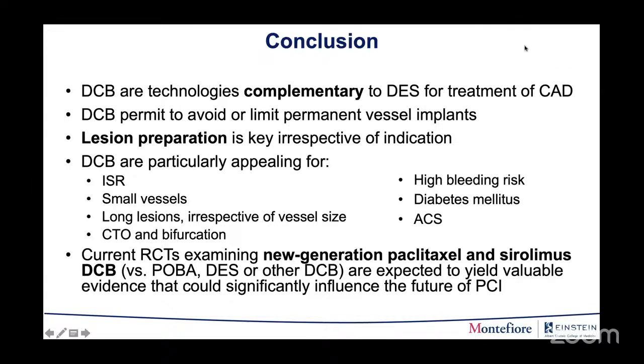Waqas, there we go. So yesterday we were doing a case of post cardiac transplant, and we saw a case of very aggressive allograft vasculopathy. Do you have any opinion or thoughts on using DCBs in CAV patients?